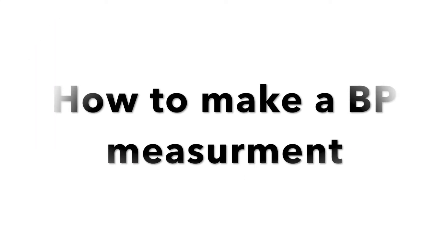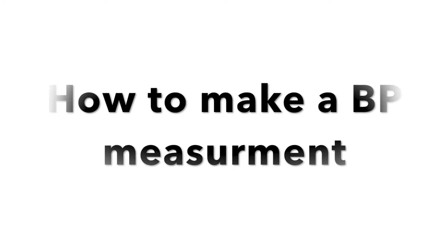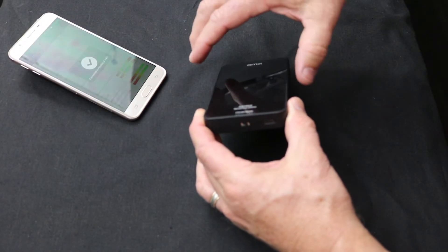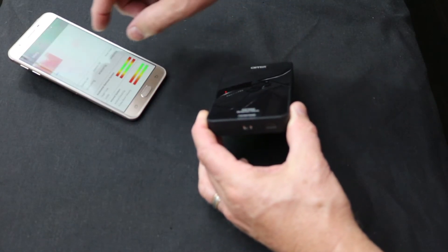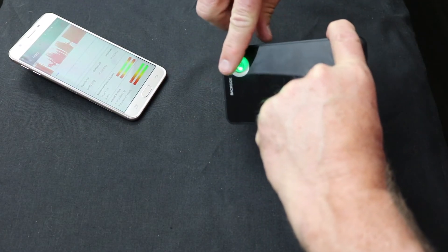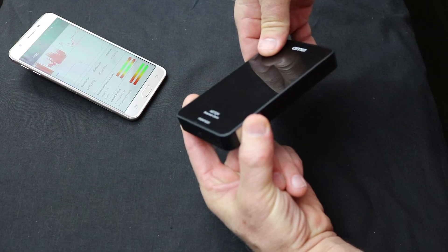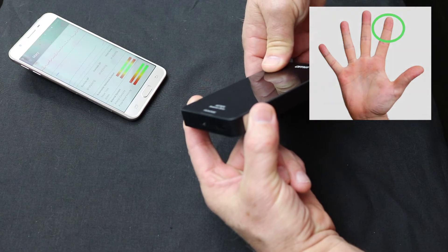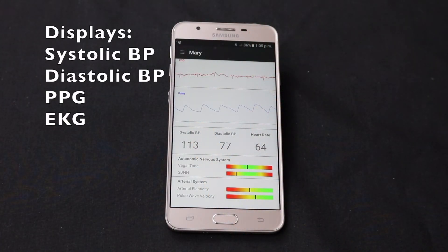To make a measurement, slide the on-off button to on. The green LEDs in the AS70XX module will now turn on. Connect the demonstrator via Bluetooth to the Nautilus mobile device app. After selecting a user on the app, hold the rectangular electrodes with the thumb and forefinger of the left hand. You will also need to put the tip of the index finger of the right hand onto the surface of the ring electrode. The Nautilus app will show in real time the systolic and diastolic blood pressure readings as well as PPG heart rate.